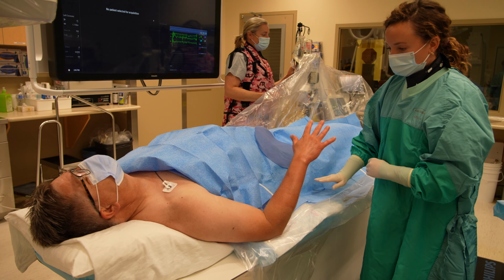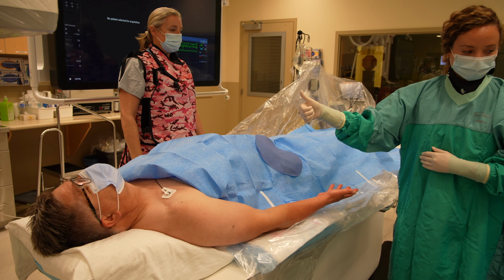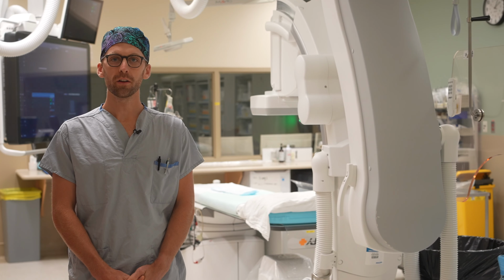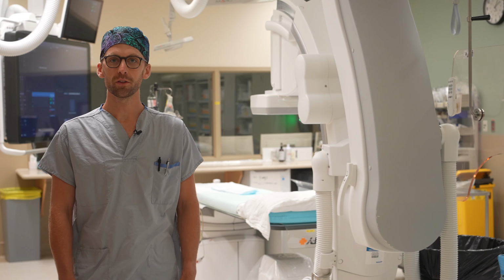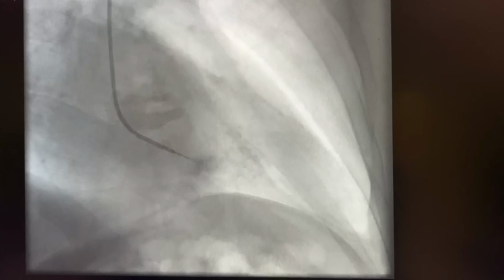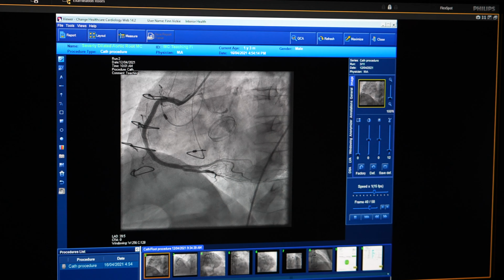Once the cath lab staff have prepared you for the procedure, the cardiologist will come into the room. The entire staff team will briefly discuss your medical history so that everyone understands why you are having an angiogram. The cardiologist will then freeze the area around your access site before inserting the tube used to perform the procedure. It is normal to feel extra heartbeats and to feel hot and flushed when the cardiologist takes pictures of the pumping chamber of the heart. The cardiologist will tell you when to expect these sensations.